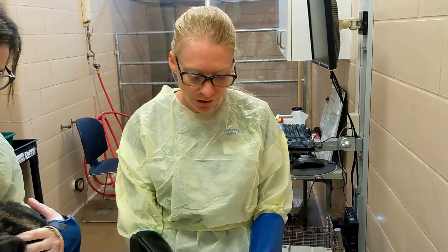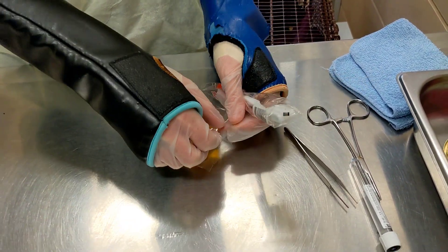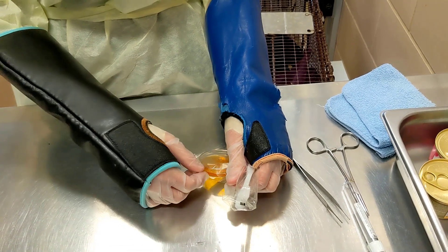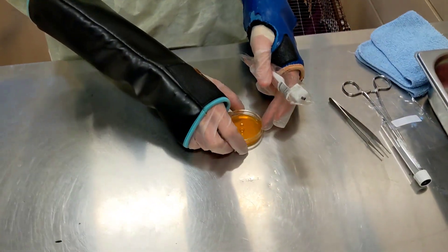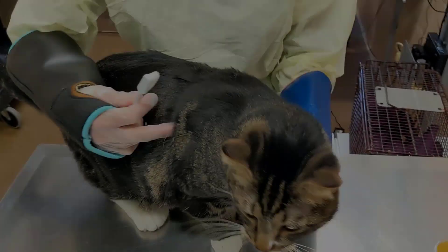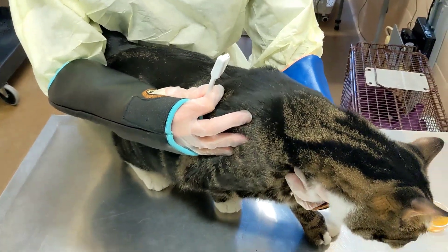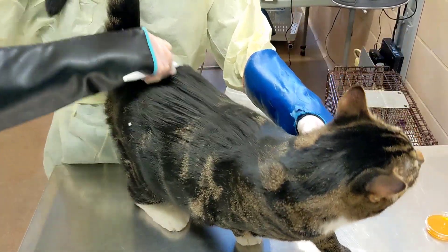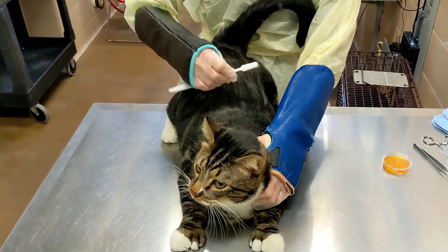Then we're going to pull for a culture. We've got our culture medium plate — this is a dermatophyte plate — and then we've got a brand new clean toothbrush. Every time you do a culture you want to use a new toothbrush. We are going to use a new toothbrush each time. So we've got our fresh plate, and in the end we're going to label the plate with the information we have. The idea for doing the toothbrush method — there are lots of different ways — but I try to remember 30-30-30. I do big swoops 30 times down the body.